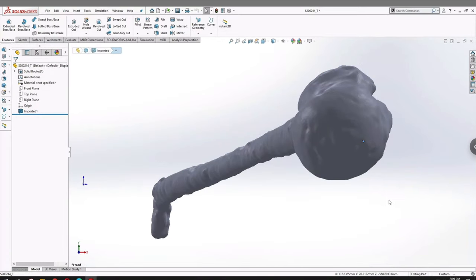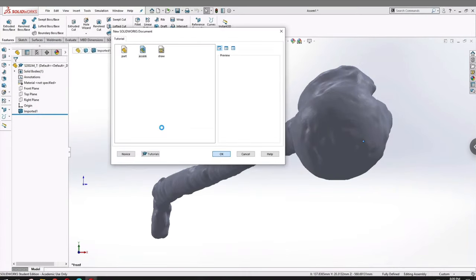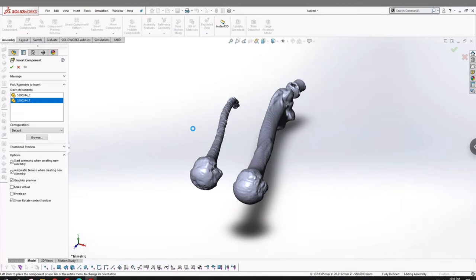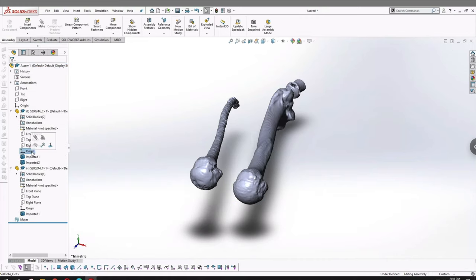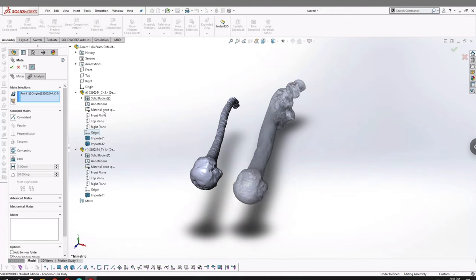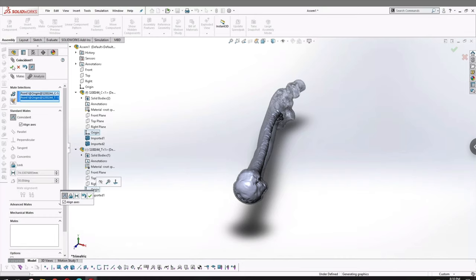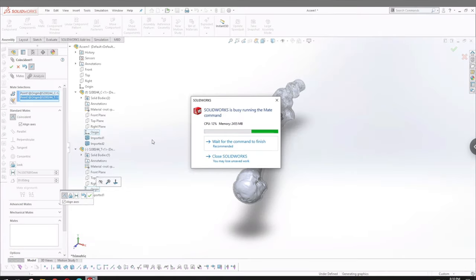So now that we've saved both of our cortical and trabecular imported solid bodies as their own SOLIDWORKS parts, of course you can put them directly into a SOLIDWORKS assembly. Now I personally like to use just mating the two origins together in order to align them correctly. And after, of course, you perform your mating function, ensure that you fix both of these parts. It's not shown here, but it's quite important, as if you're performing any reaming or position procedures for implants, you really want to make sure that these two solid bodies don't move with respect to one another.